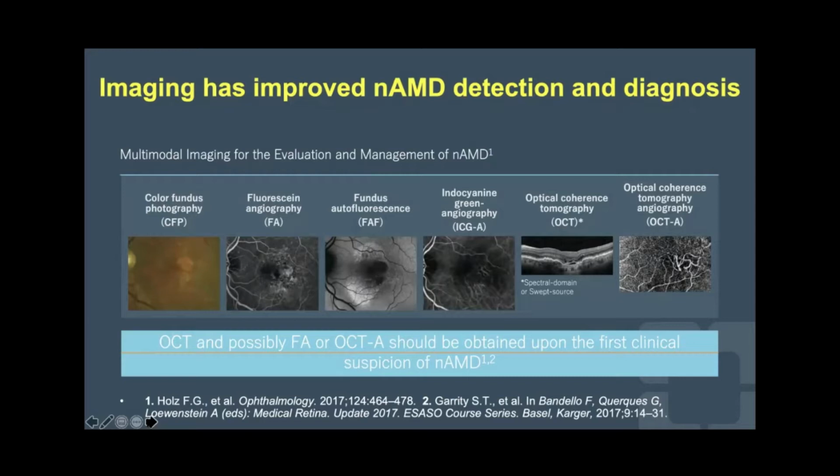Fluorescein angiography determines leakage if there is truly a membrane that we're concerned about. Fluorescein is our gold standard, as always, for this disease state. Fundus autofluorescence is good for looking for atrophy as well as ruling out masquerade syndromes like central serous. And ICG, obviously, when you consider the condition of polypoidal or feeder vessel lesion treatment.